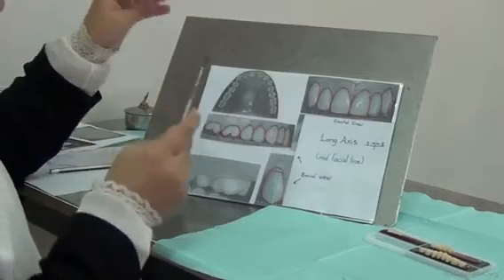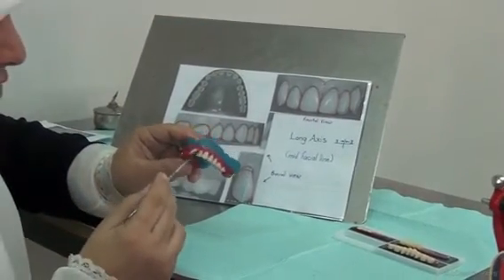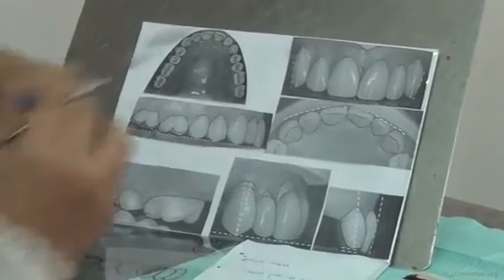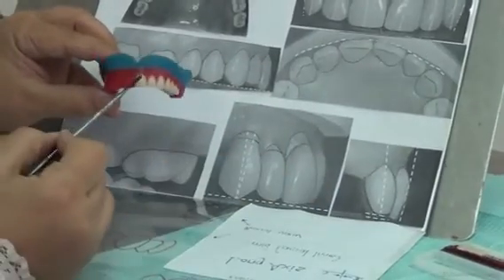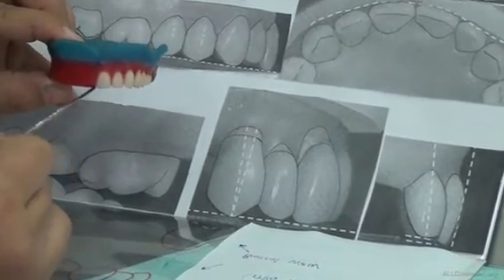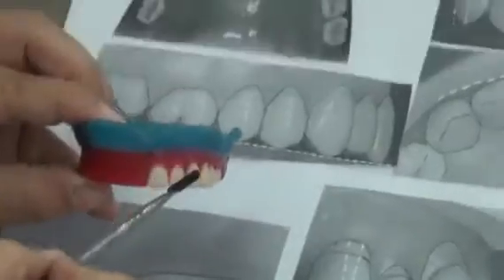Once we have this finalized, one last point is the root angulation of the teeth. If I look closely at the teeth, in the root angulation, I find that the central should be tilted labially a bit. The root is depressed. So if the incisal edges are on the arch lines that we explained, the external arch line, the roots are not at the same level.